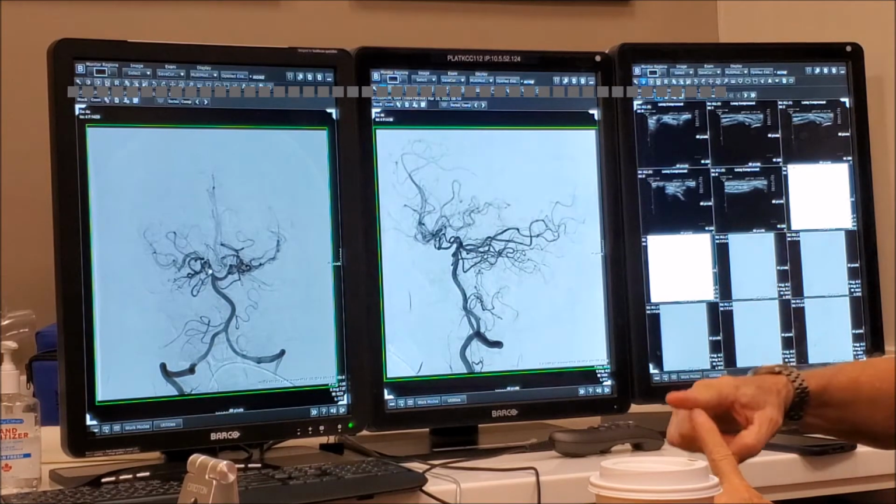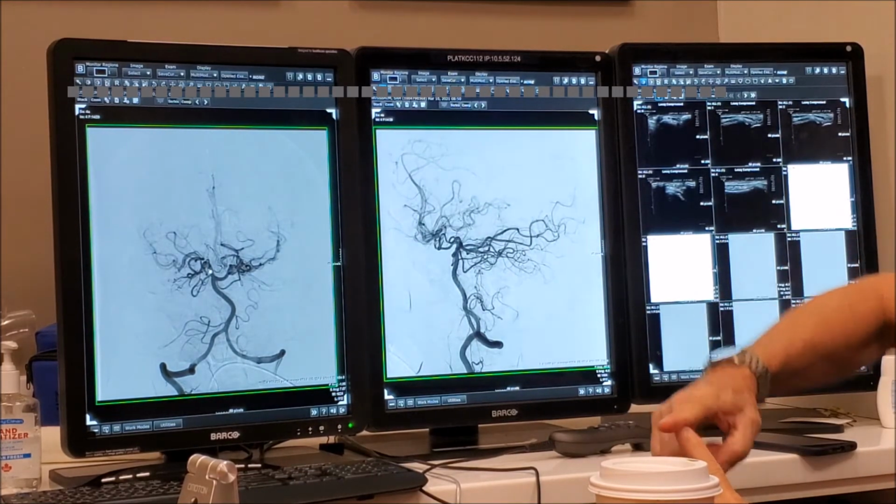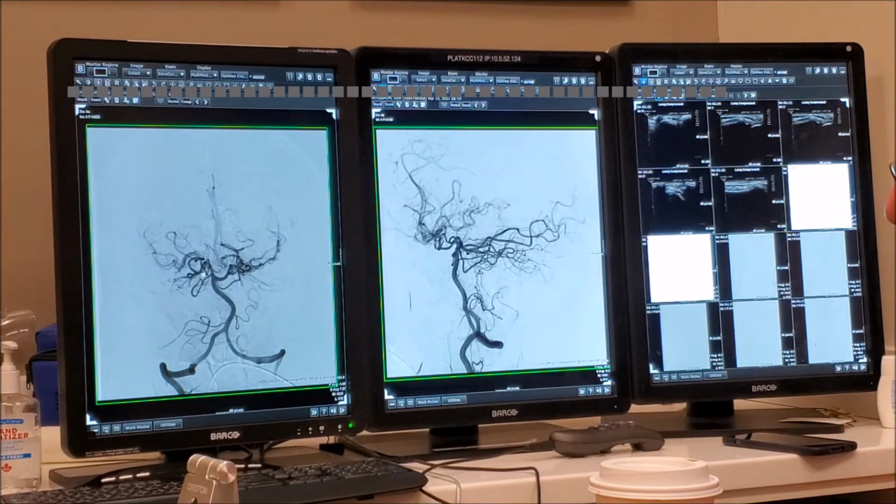When you have a perfect T, it is more balanced, okay? So this is telling us that there was some kind of a... now I can predict a small PCOM here. And we'll see, because we have the MCA. Jeez. So I have very peculiar vessels to skip this, huh?